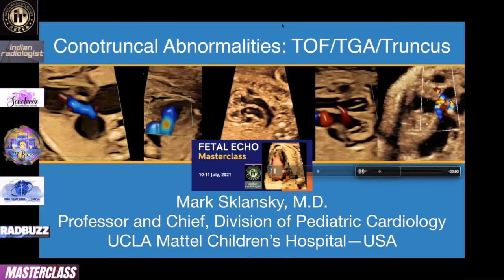Thank you, Dr. Mark. That was really wonderful. And we've got a few questions. If you could answer them, please. We'll start with Dr. Arvind. He says, findings on 3VV in tetralogy of Fallot: is abnormality in 3VV a rule or exception in TOF?